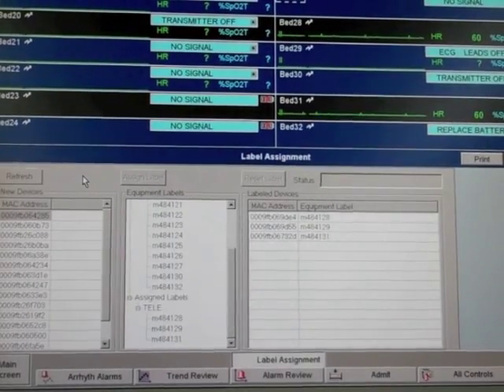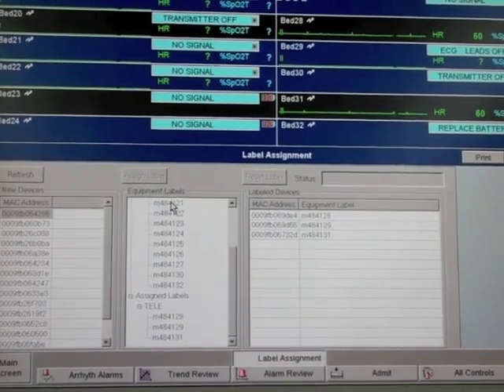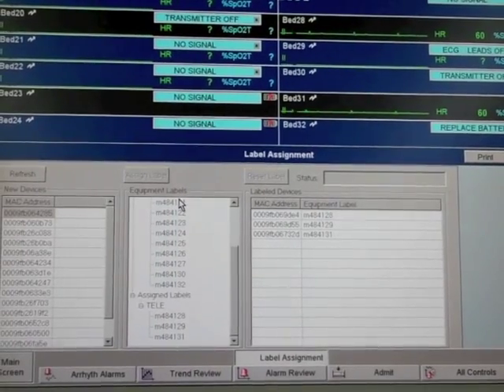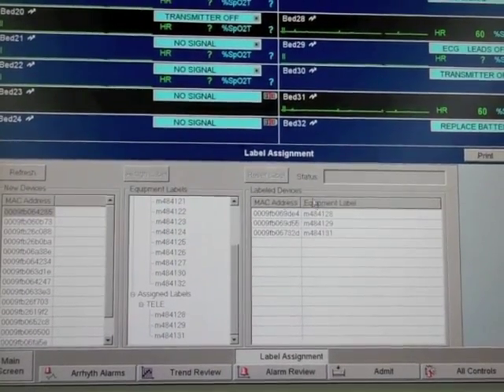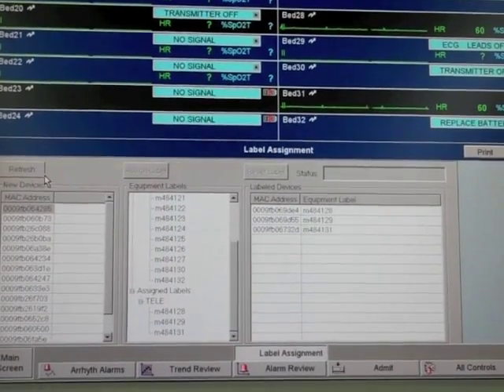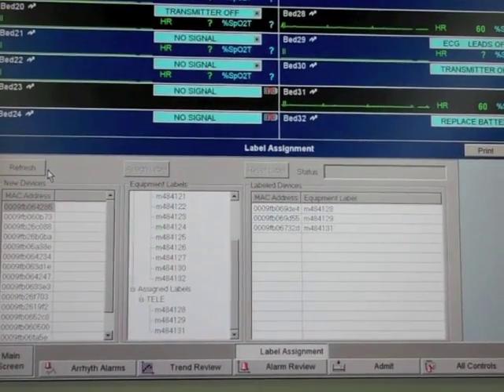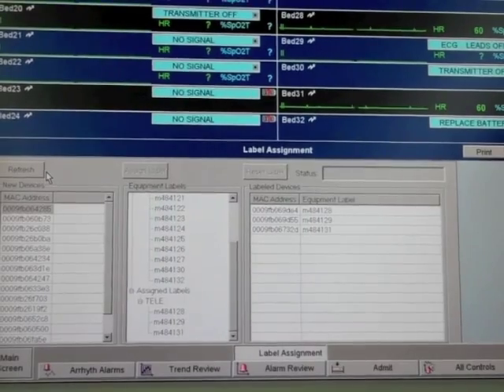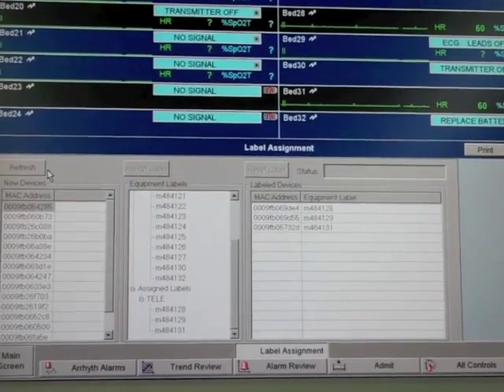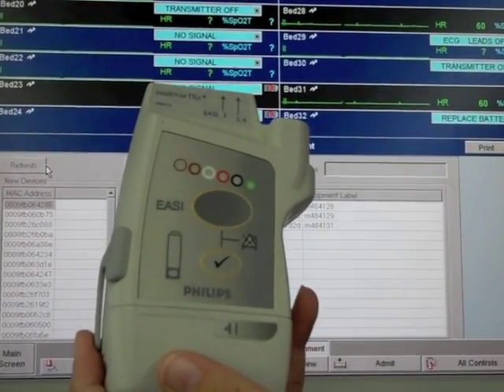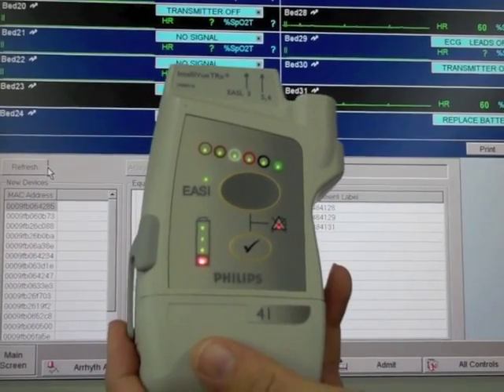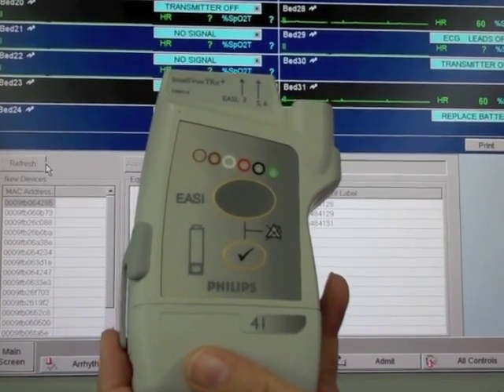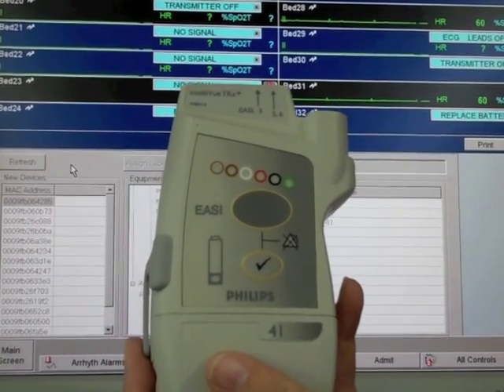This is where you're going to find the list of your MAC addresses, your bed assignment, equipment labels, and the end status over here. So you're going to put your battery into your transmitter. You'll see the light configuration pop up and you'll hear a constant beep when it's looking for a signal.